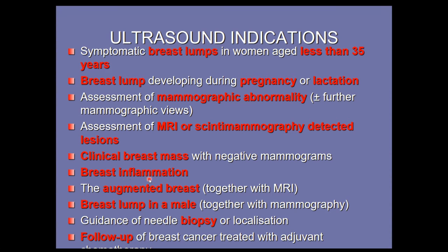Or if the breast is inflamed, for example, there is an abscess or there is diffuse inflammation, in that scenario, we cannot perform mammography. Why? Because we are giving compression. If we give compression to an inflamed breast, it will cause severe pain to the patient. We will not be able to perform mammogram. So in these cases again we will perform the ultrasound.